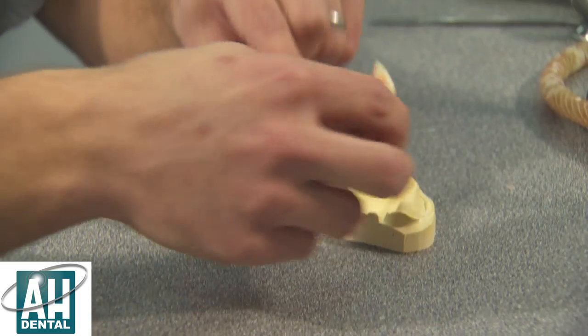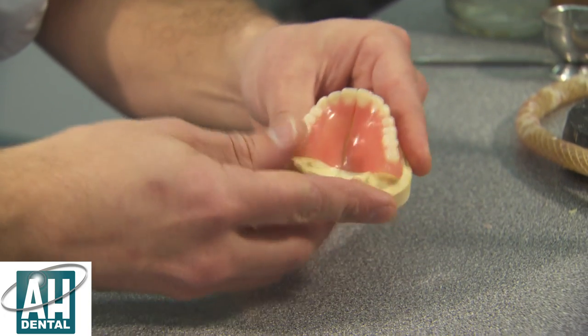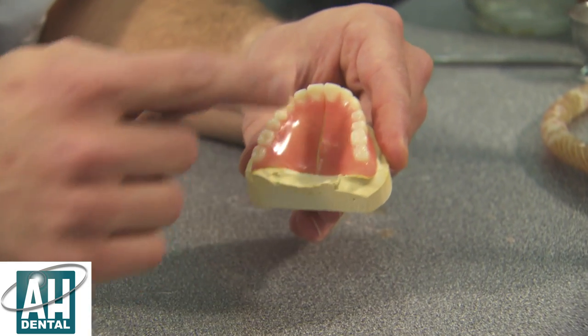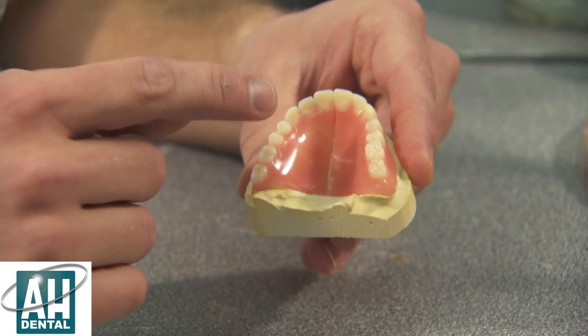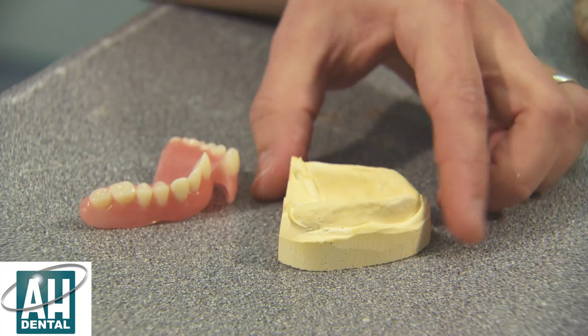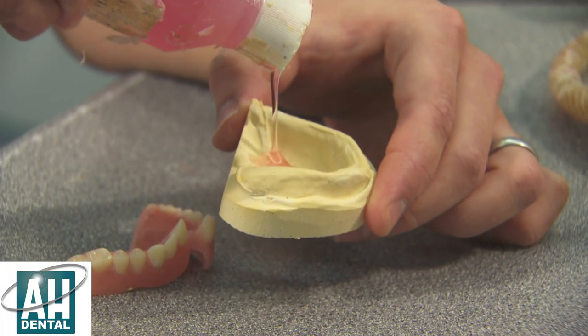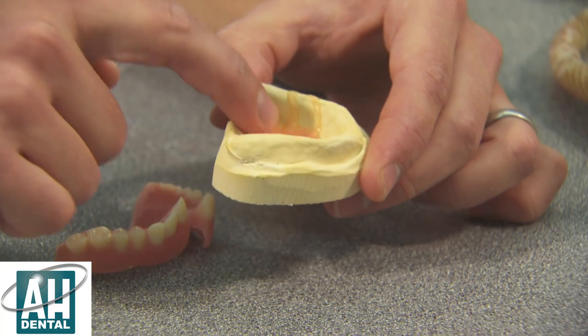Now both halves of the denture have been trimmed. I'll put them back on the model and you can clearly see there's now a channel being created in between the two halves. This is going to be filled with new acrylic. We now have to put some isolating solution on, and this stops the new acrylic sticking to the plaster model.